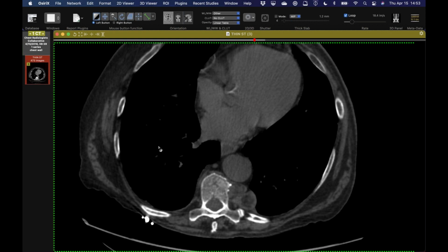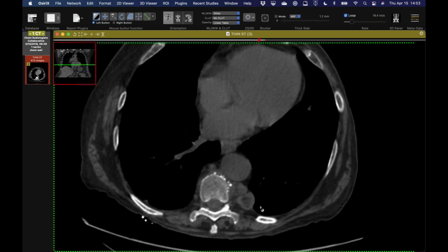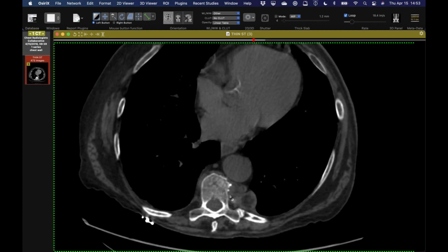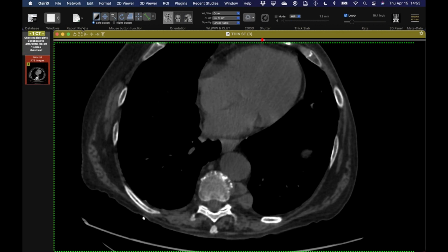No, but you know what I would have thought of, and I still think preferentially, is the unusual circumstance of extramedullary hematopoiesis, even if the patient doesn't have a reason for that. On occasion, that can occur as a sporadic, unanticipated finding, a focus of extramedullary hematopoiesis. Yeah. I've not seen a myelolipoma like that. No. Yeah.